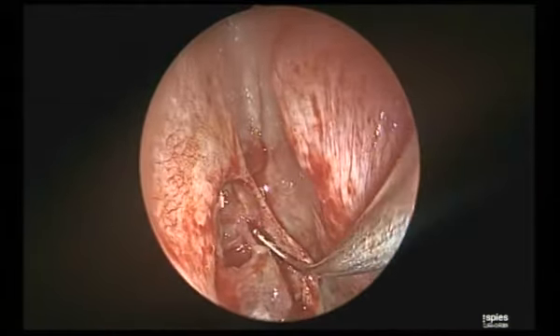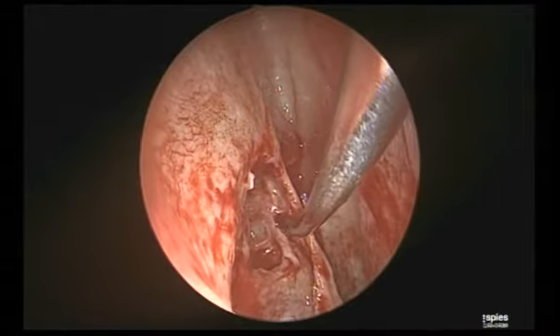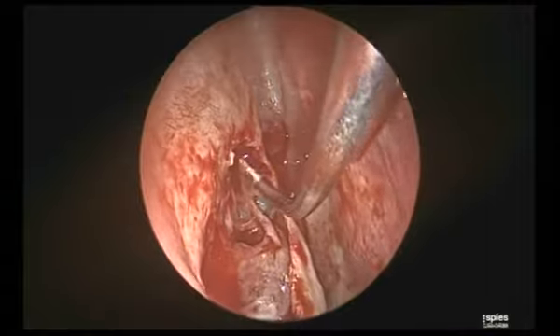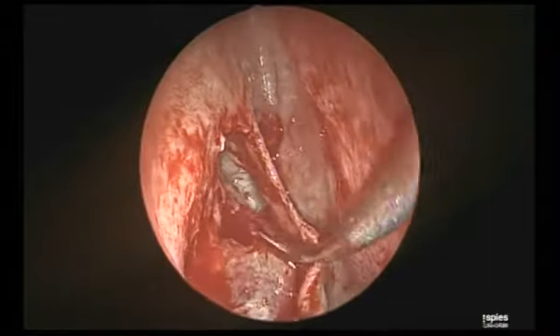Now the important thing in this region is to keep your instrument directed laterally. See, I am in the cleavage. I am behind this cell. Sometimes it is fused. Yes, we can see the transparent probe behind. Fantastic. I am going to go behind this cell laterally and fracture it out.